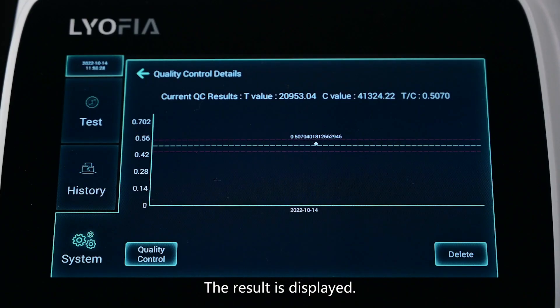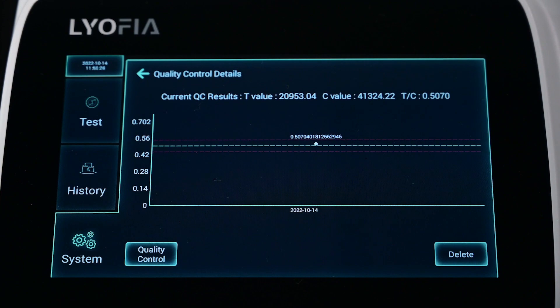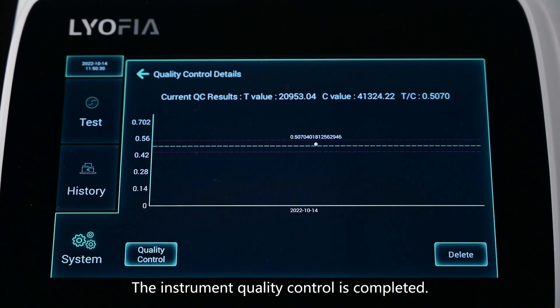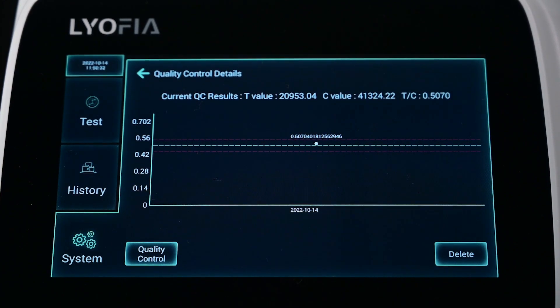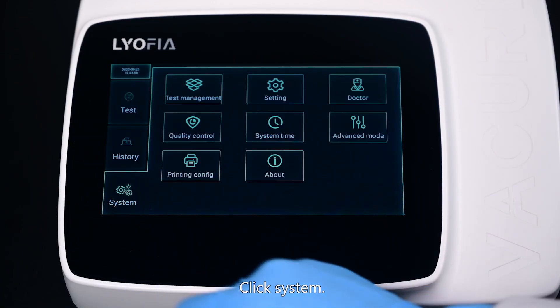The result is displayed. The instrument quality control is completed. Click System.